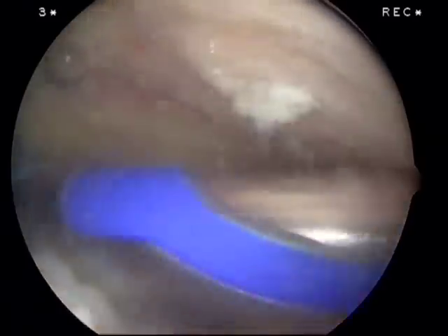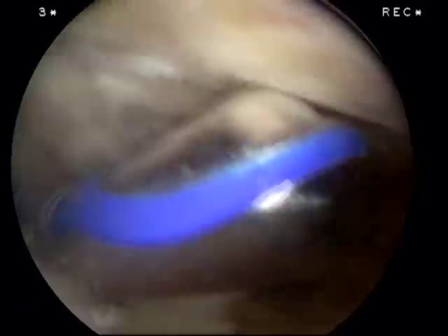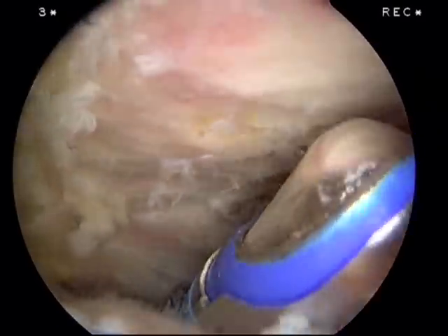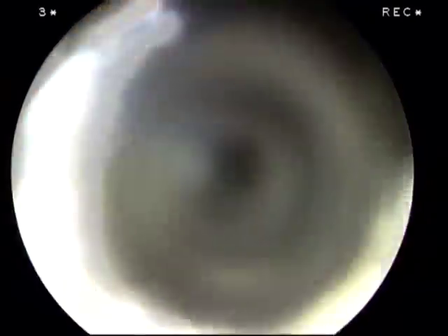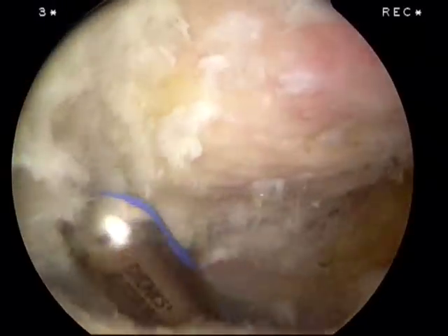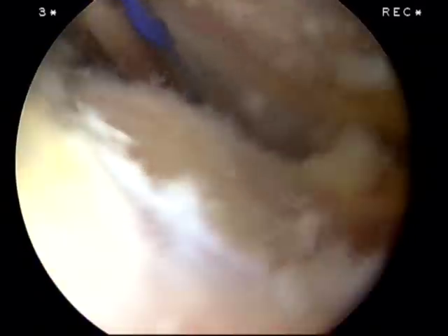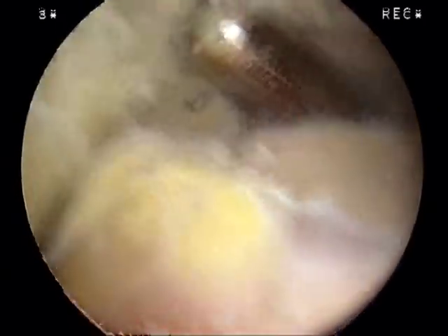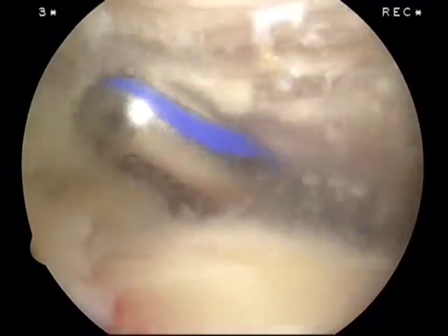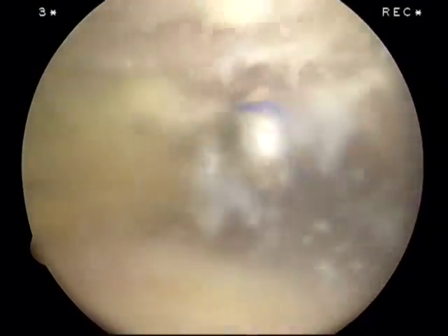Again, we're at the arch of the acromion — this is the posterior acromion. Moving back towards the camera: posterior lateral edge, all the way over to the lateral edge of the acromion. I've already got it isolated out; you can see where it starts to head up — the deltoid attachment. Then we work towards the anterior acromion, cleaning it off. As we cauterize to outline this, we're basically doing our bursectomy.